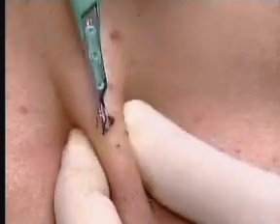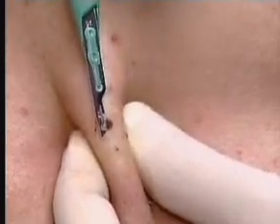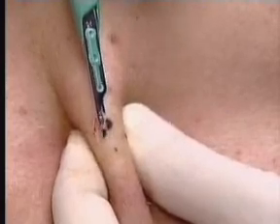When partway through the dermis, slice horizontally and shave in a gentle back and forth motion until you are beyond the mole. Then pick up the severed mole with the forceps and complete the incision, cutting at a 45 degree angle. It is important to make sure all the pigment is gone. The incision is almost like a controlled scrape.